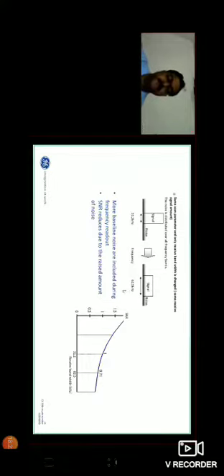We are getting some advantages by increasing the bandwidth. That means if you are increasing your receiver bandwidth, you can minimize your minimum TE. That will help to remove some of the susceptibility artifacts from your EPI based sequences like diffusion or brain perfusion imaging, fMRI imaging. It also helps to eliminate the chemical shift artifacts. We'll see how it is eliminating.